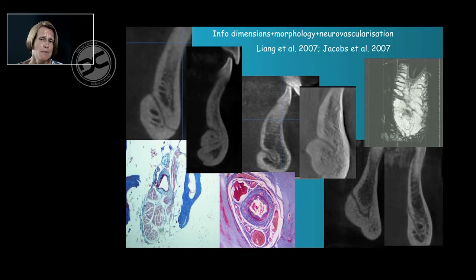The placement of implants in the anterior mandible has been for a long time a debate, yet the presence of a complex neurovascular network and a high variability amongst patients, as you can see here, the midline area in different patients almost fingerprinting the patient, with the presence of a true neurosensory bundle together with arterial blood vessels in those canal contents, makes it very relevant to, even in this area, use a cone beam CT and avoid traumas as those shown before.